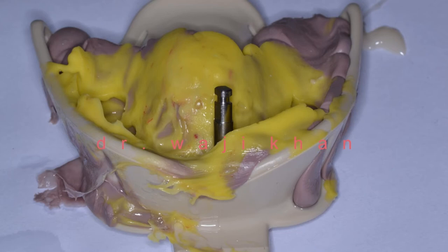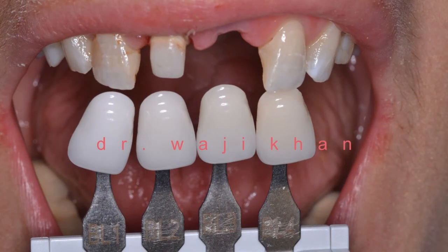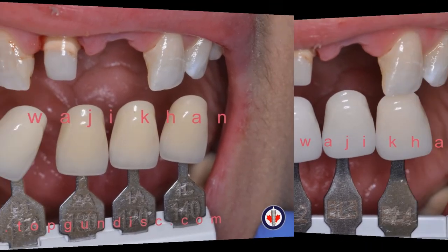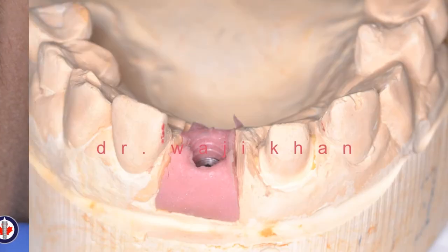For impression material we used the 3M Imprint. We also like to place the analogs on the impressions ourselves to avoid problems at the lab with components spinning. For shade taking, the more information you give the lab — pictures, x-rays, shade guide data, along with good models — the better the lab work you'll get back. We take both the stump shade and the final shade for the lab.